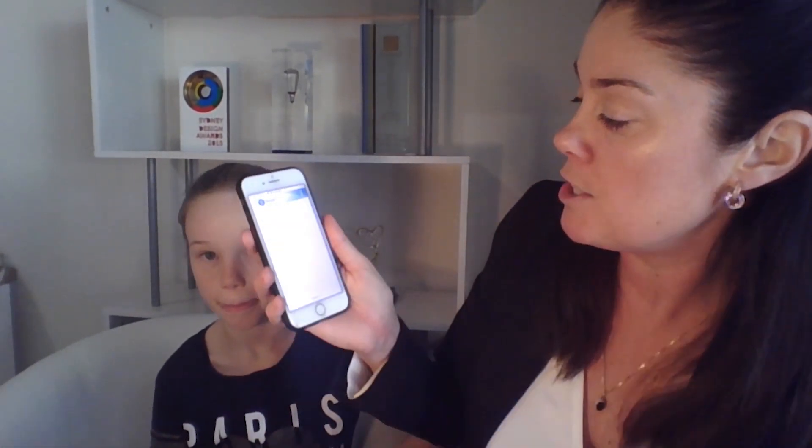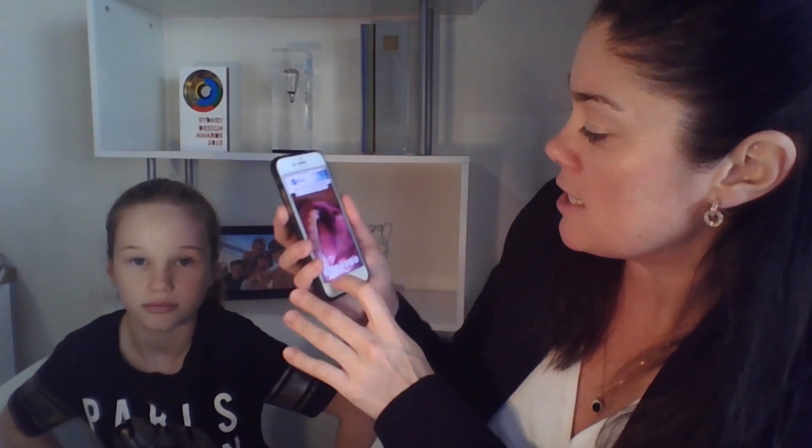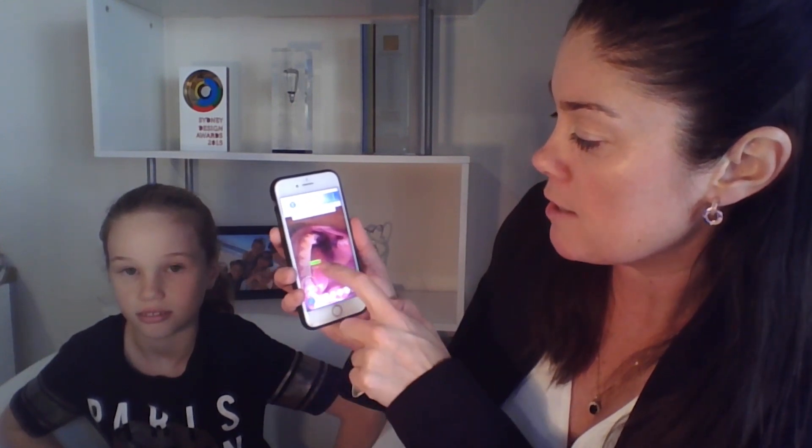Now that you've done that, you can simply click on the gallery within the app, and you can see that it brings up all the images. You can click on one of the images and, for example, show your dentist a sore tooth — you circle which tooth it is, right here. Then you can measure it as well. You can also add a comment on there. Once you're done, you simply email it through to your doctor or dentist for a second opinion. It's that simple.